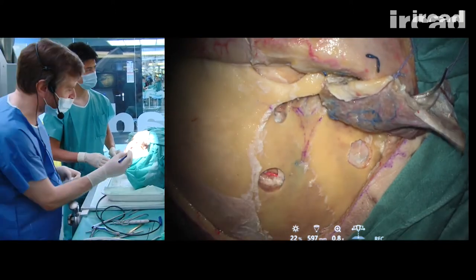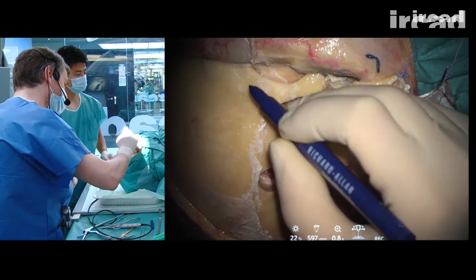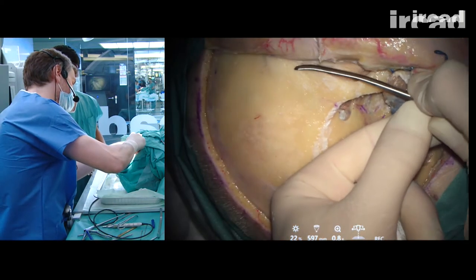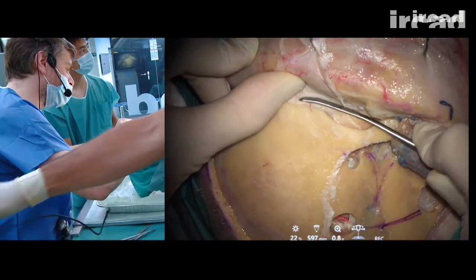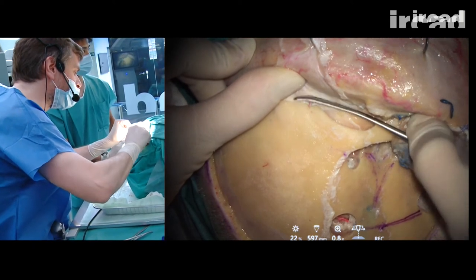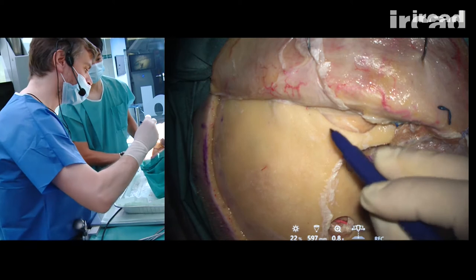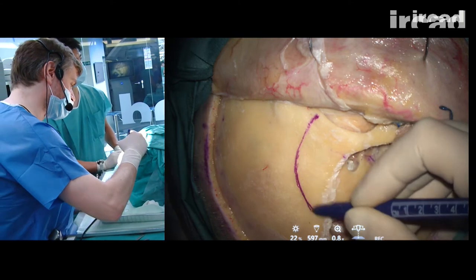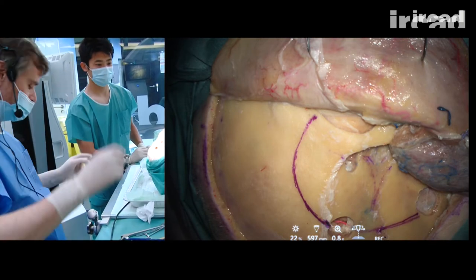Okay, the only thing here that will be difficult, I think, is to preserve the dura mater. And I have to finish here lateral to the supraorbital nerve, which is, I believe, in this area. Here is a notch. Here must be the nerve. So I want to finish lateral to this. Lateral to this, yeah. Okay. Baisser.